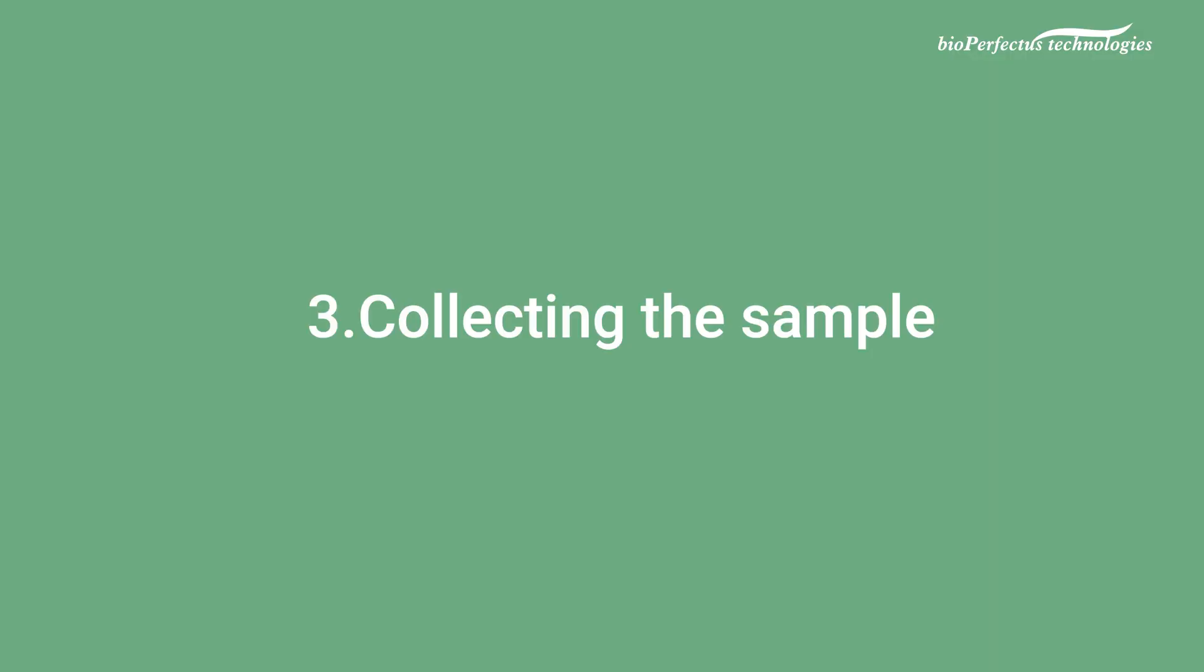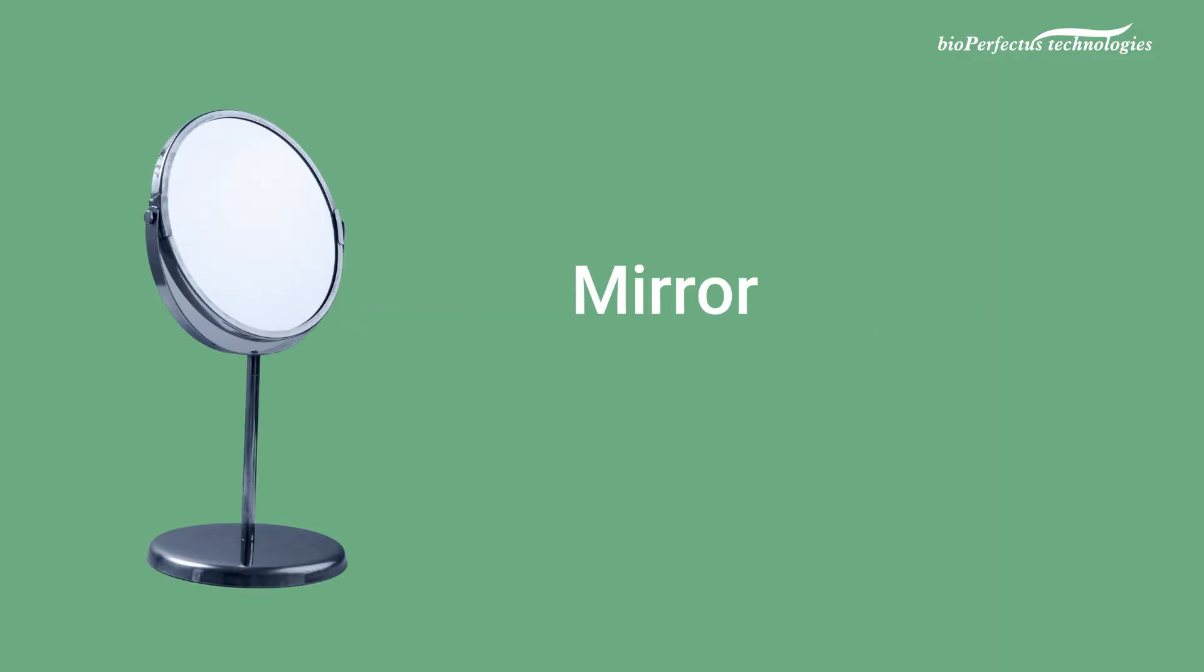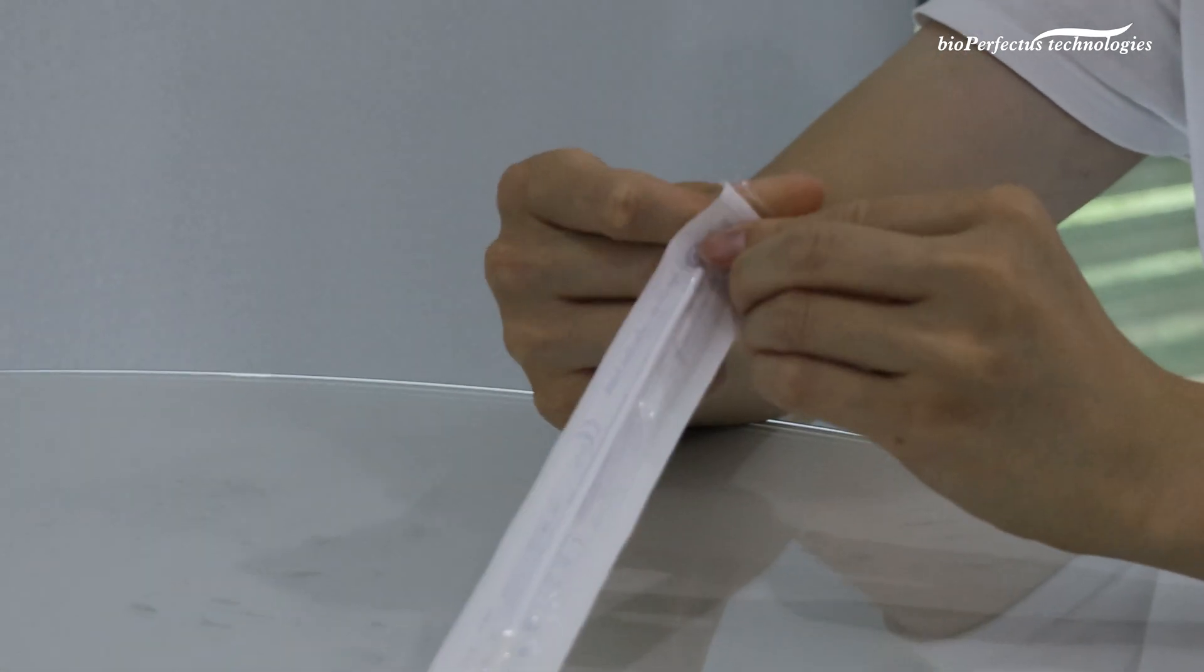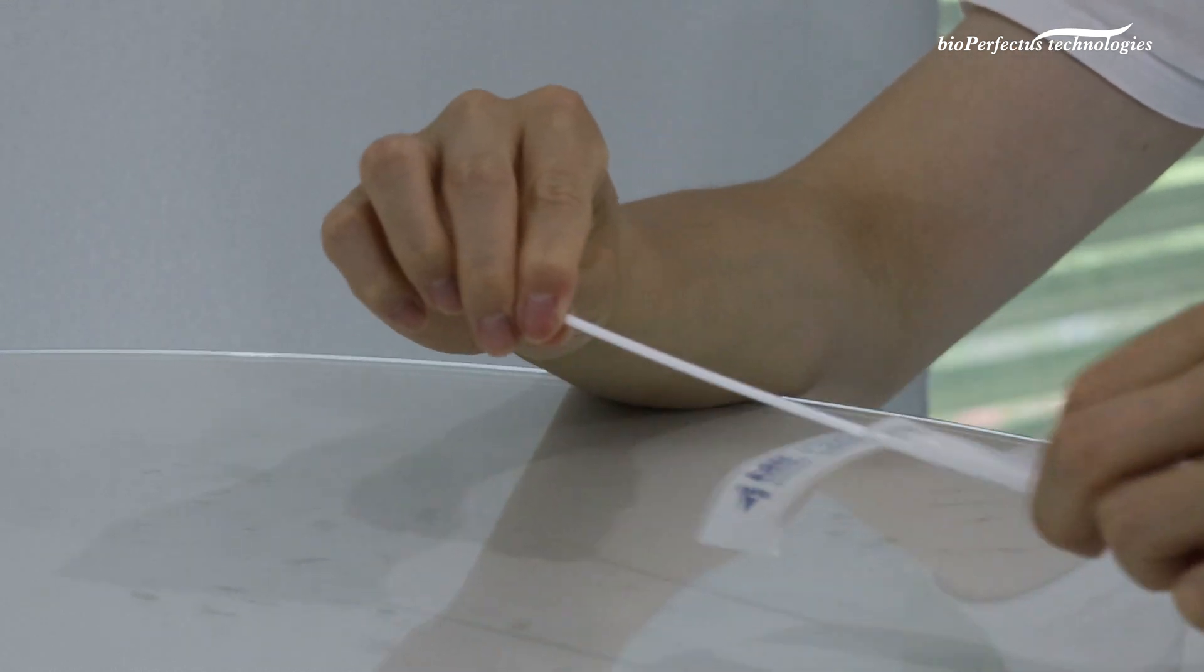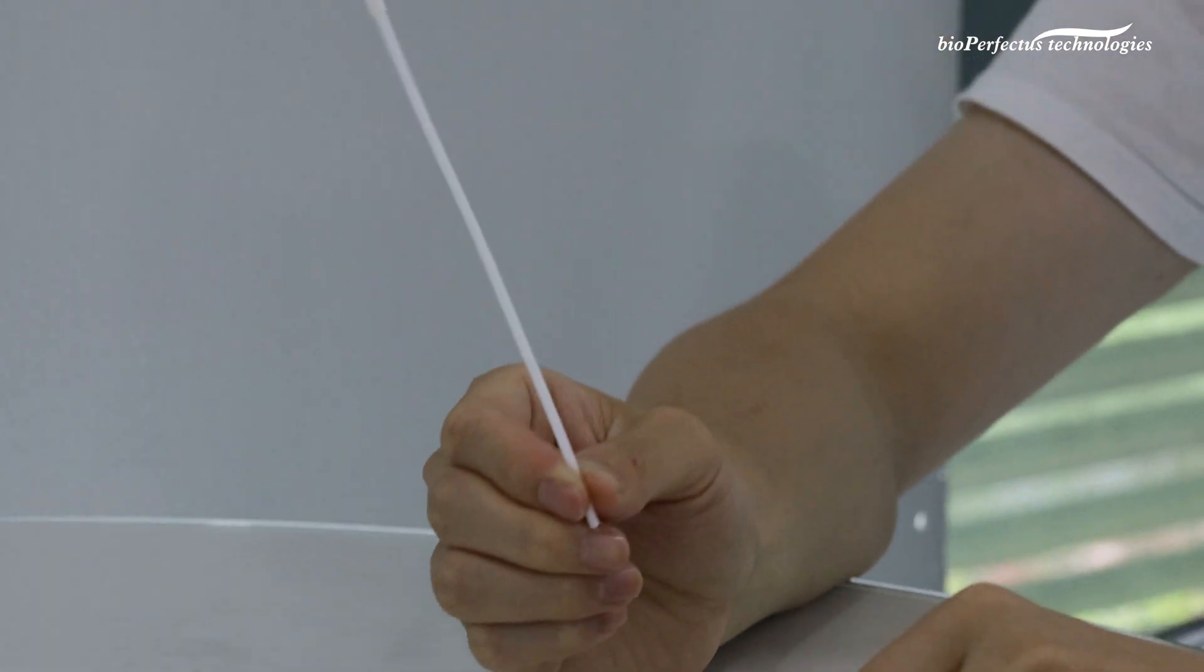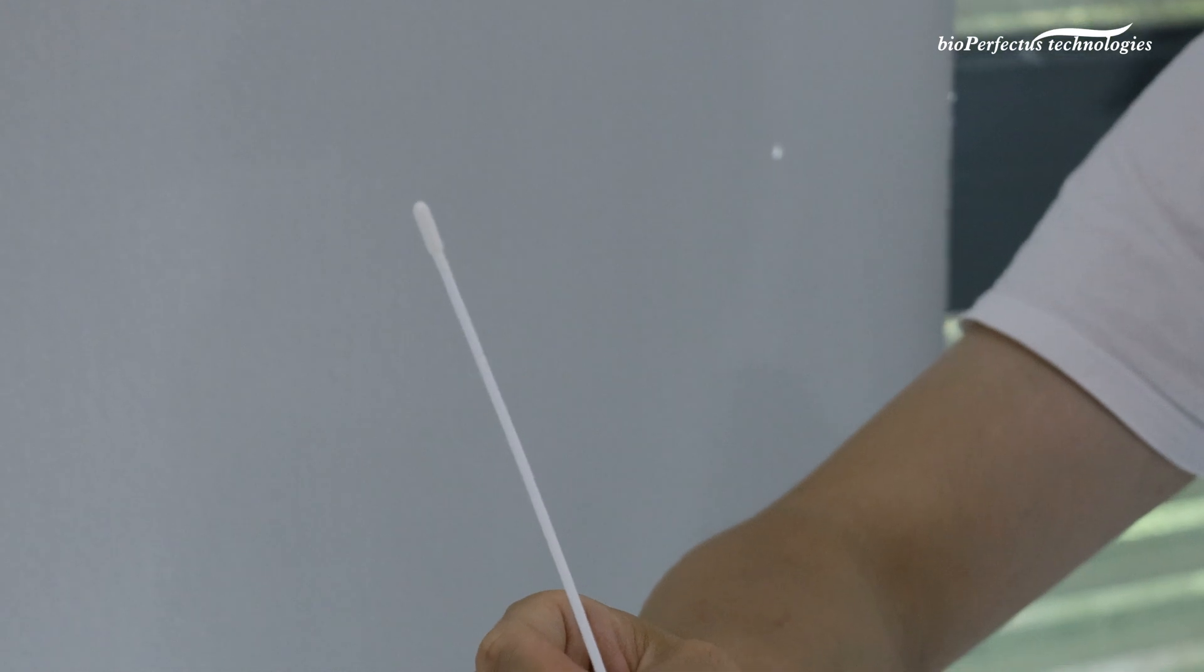Step 3: Collecting the sample. You can use a mirror to help you do this correctly. Remove the swab from the packet. Make sure you do not touch the soft part of the swab.